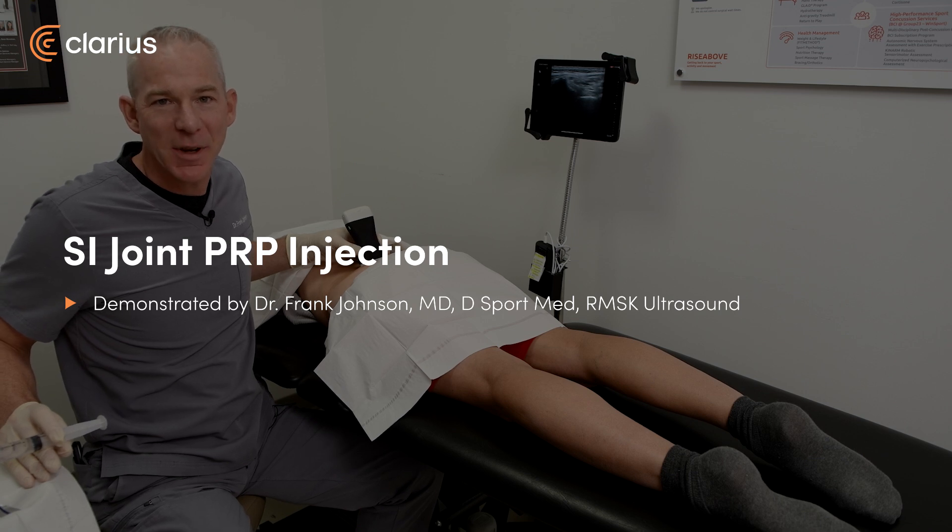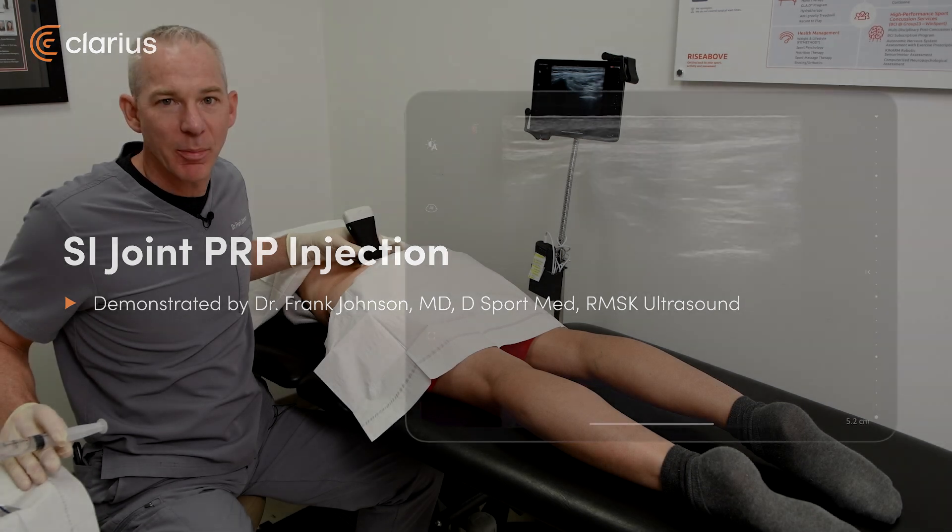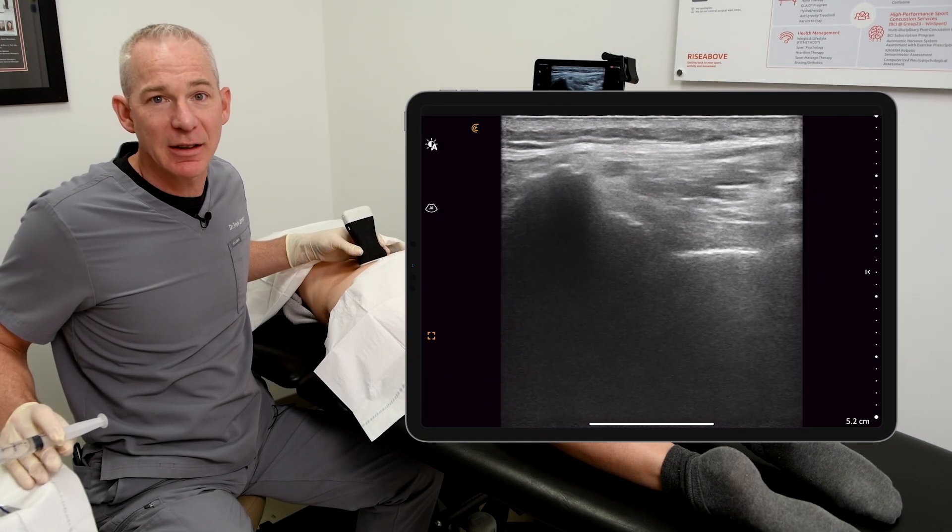Hi, Dr. Frank Johnson from Sports Medicine Ultrasound. Having just completed the lumbar facet PRP injections, I'm now ready to inject the SI joint.